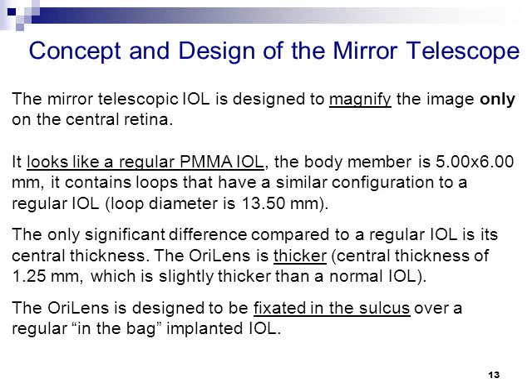The only important difference between the OriLens and a regular IOL is its central thickness, which is 1.25 millimeters compared to less than 1 millimeter in regular PMMA IOLs. The implant is designed to be fixated in the sulcus over an existing in-the-bag or bag-in-the-lens IOL.